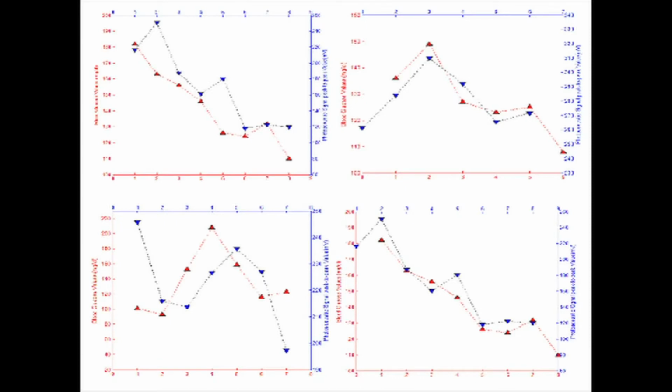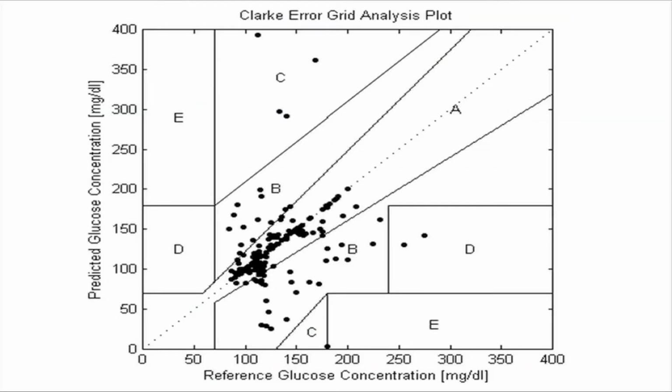Finally, glucose tolerance tests were performed and photoacoustic measurements were performed simultaneously with blood glucose measurements at periodic intervals during the test. The measurements obtained correspond to each other as shown. Calibration of the measurements shows 70% of the measurements to fall within an acceptable accuracy range.